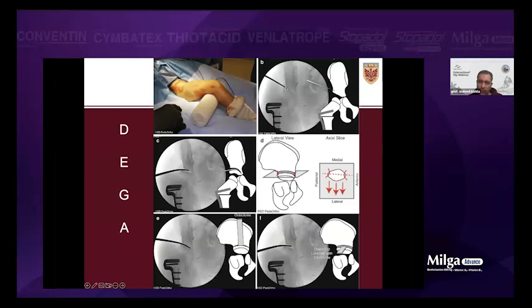I start a little bit higher than this demonstration because, as I mentioned, I get better coverage. But Professor Al-Ashab mentioned a very good point: try not to get over coverage so you don't face femoral acetabular impingement in the future. So you do your cut curved, make it parallel to the acetabulum. I stop 5 millimeters above the triradiate cartilage. And then with the osteotome, I bring it down there. And if you see from the side, that's a difference.